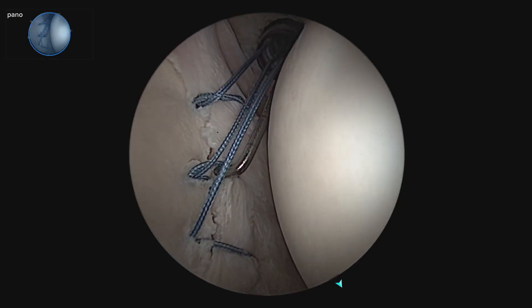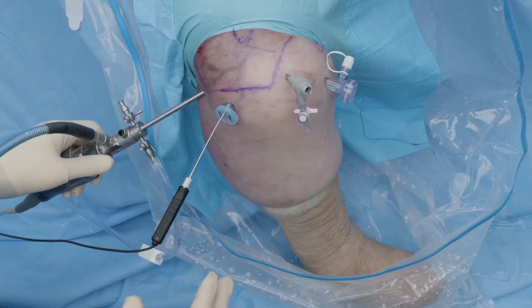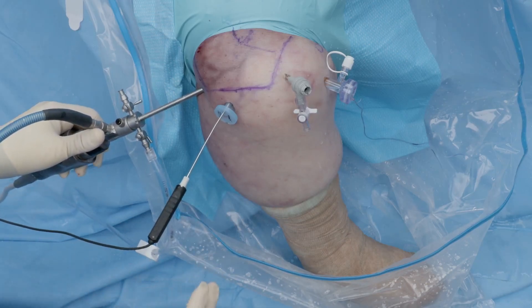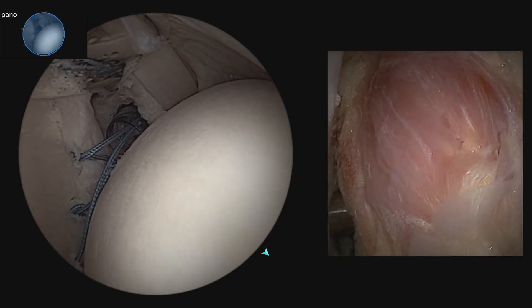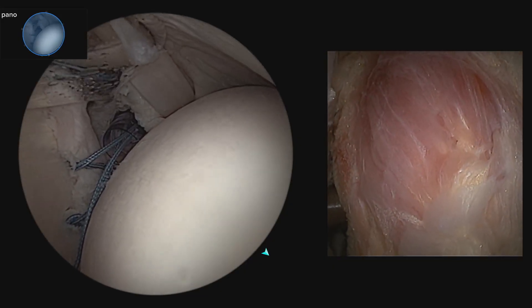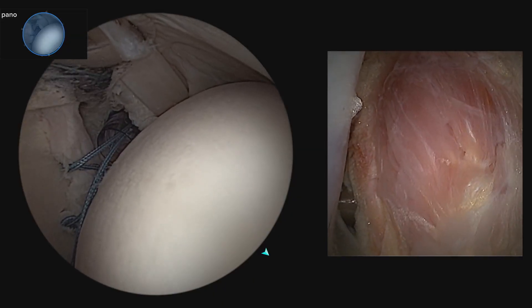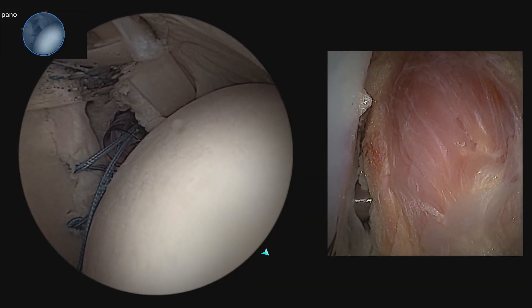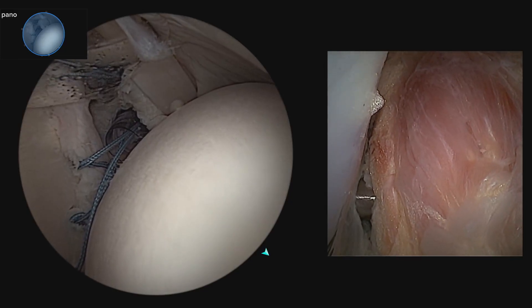We will tighten this up at the very end to complete the repair. Now we have the nanoneedle in the subacromial space. We prepared it, taking note primarily of the posterior space, getting rid of the bursa so we can see the musculotendinous junction of the infraspinatus — our target for our needles and for our remplissage. You can even see our panoscope going through intra-articularly into the subacromial space.